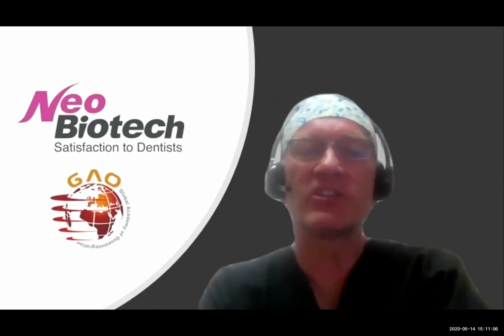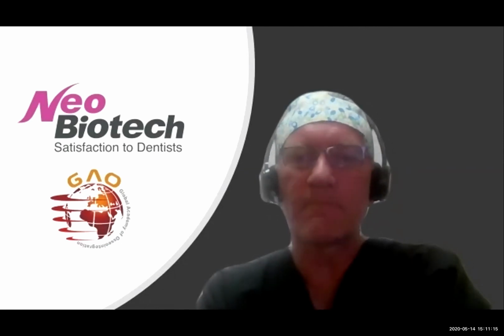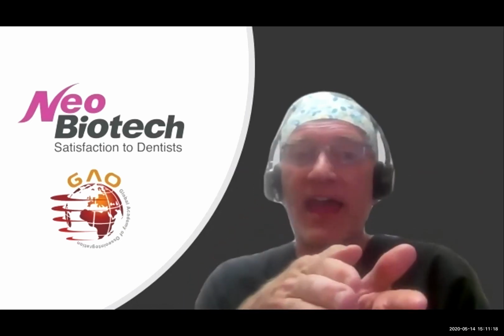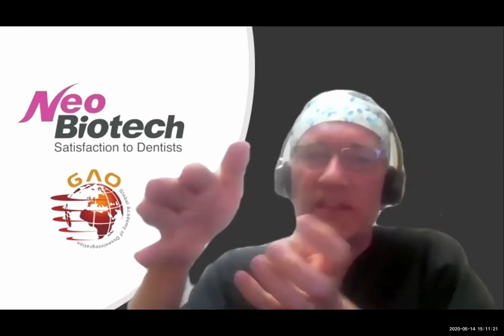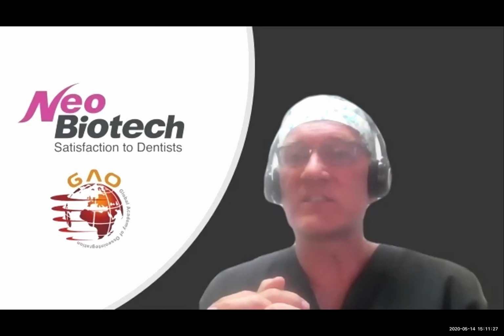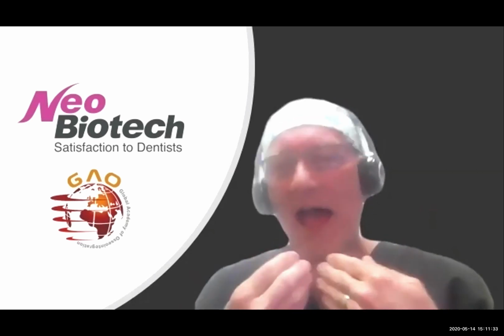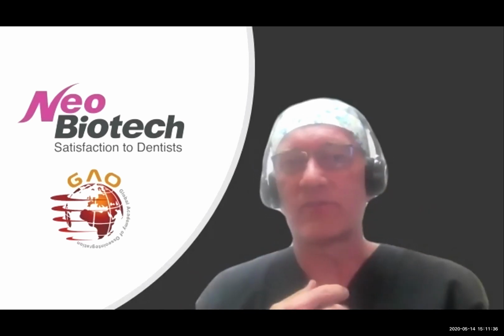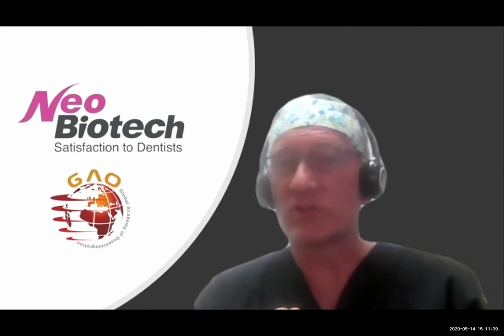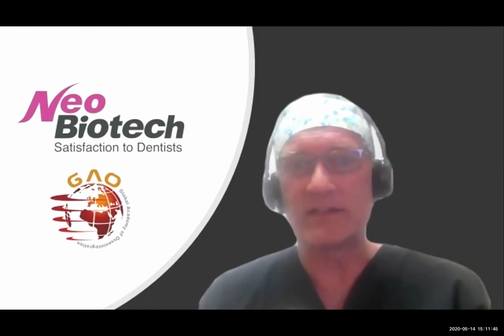Last question. No, it's not, there's another coming in. Do you use PRF or CGF along with the tunnel bone graft? You could do that, and that would be okay if you choose to. The difficulty is creating the opening and having the PRF hold it open so that you can then put the bone underneath. If you can place PRF inside of that, and then come and place your bone underneath your PRF, you could do that. I just find that it's quick and easy enough to just use my resorbable membrane, and I'm getting good enough results with that that I don't need to have extra things.